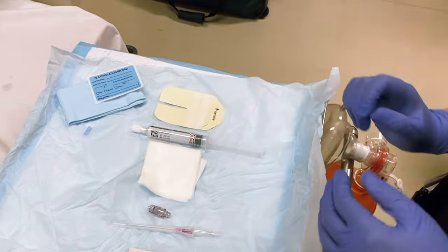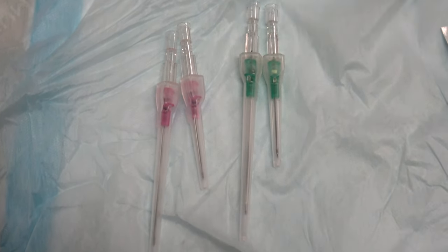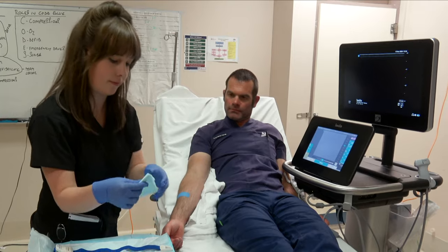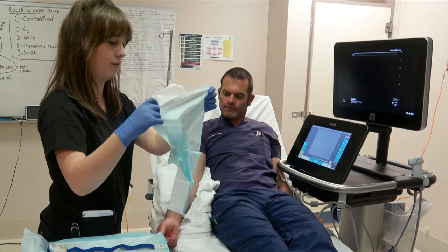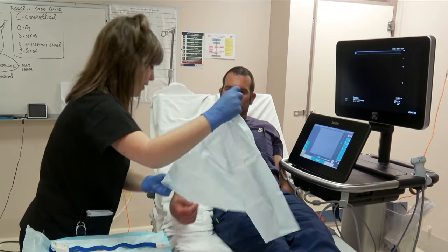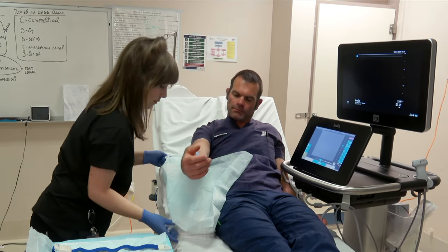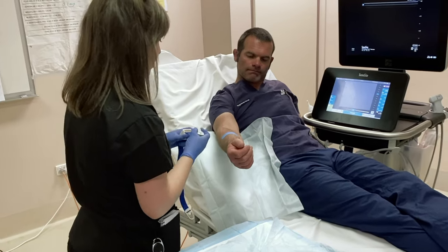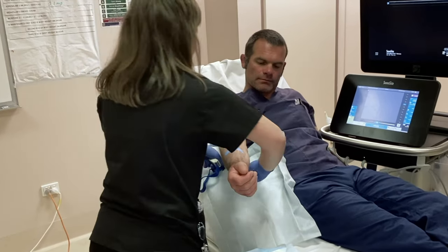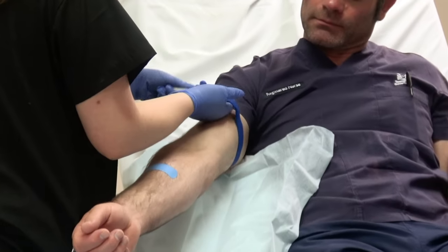Remember, this technique requires a longer length cannula. Place your patient's arm in an optimal position and lay an absorbent sheet and pillow underneath.